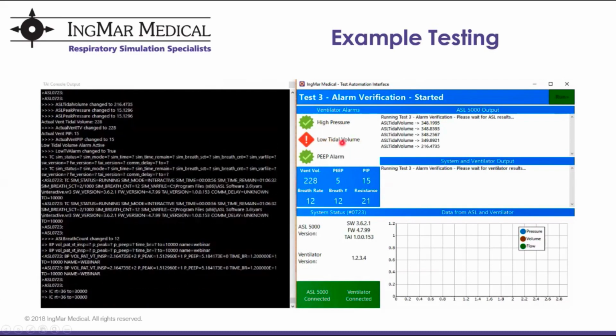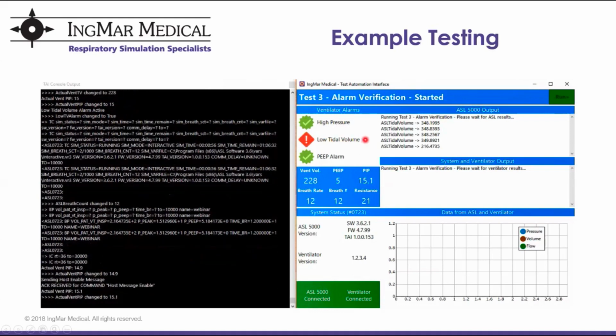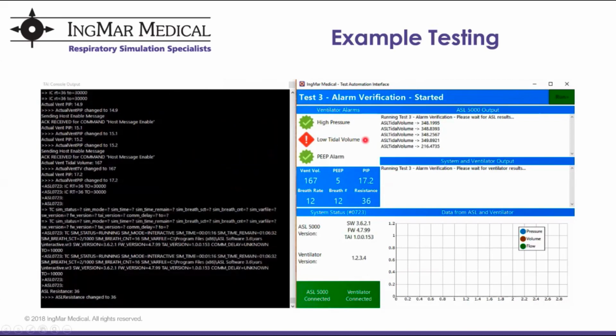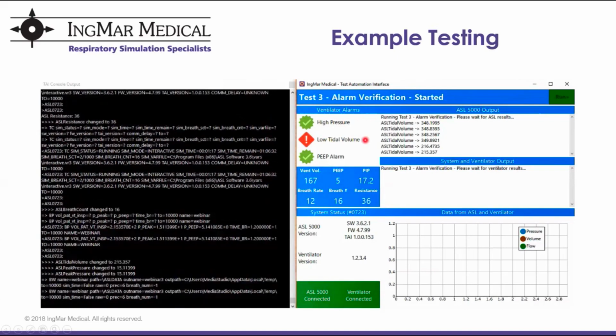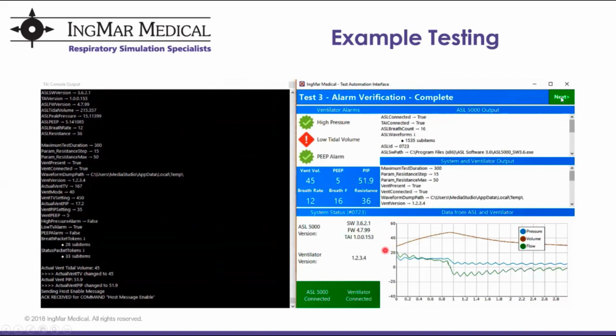And our simulation will end with another waveform that depicts the patient's breath that triggered the original alarm. And that should be ending one moment here as we get to the high level. And we're done. And that's our simulation test.